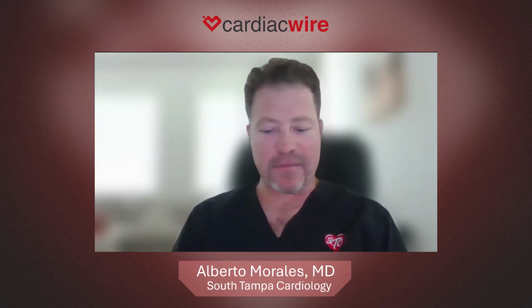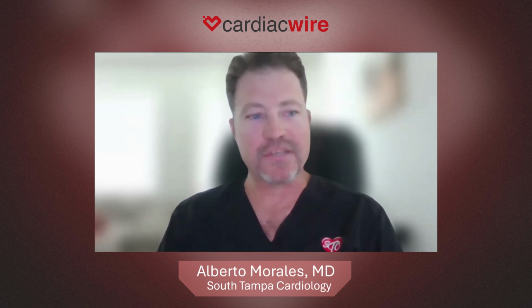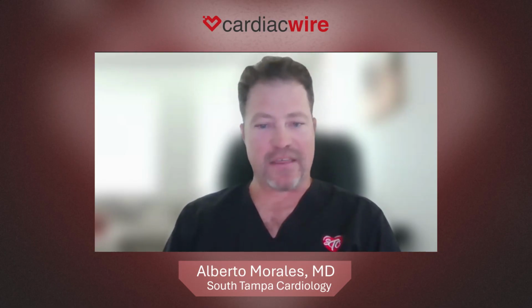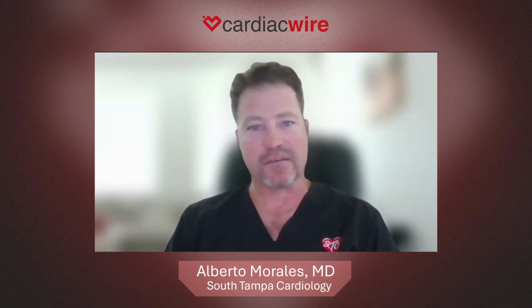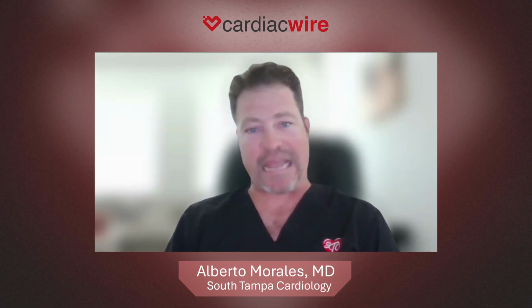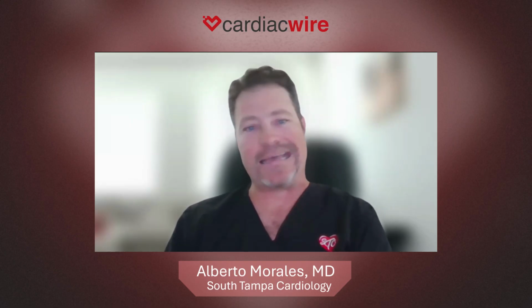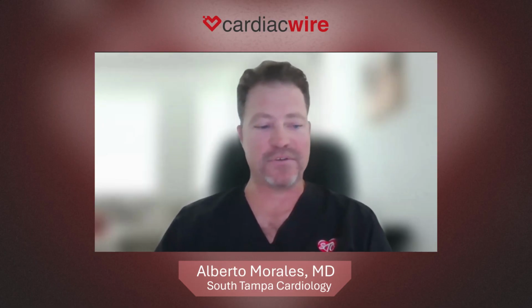I would agree. As an advanced imager, I do vascular imaging as well, and we read carotids and vasculars. We're speaking about this AI and Elucid, and clearly the limitations of AI are really based on the limitations of your scanner. If your scanner is of inferior technology or low spatial resolution, with lots of artifacts, then the AI is not going to be as superb as you desire.